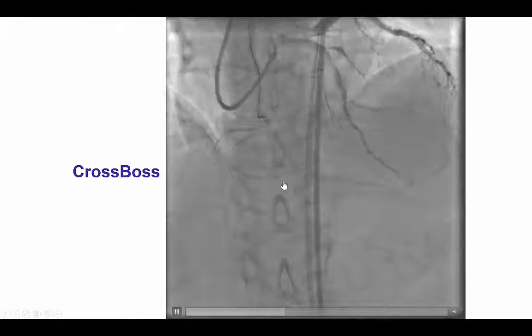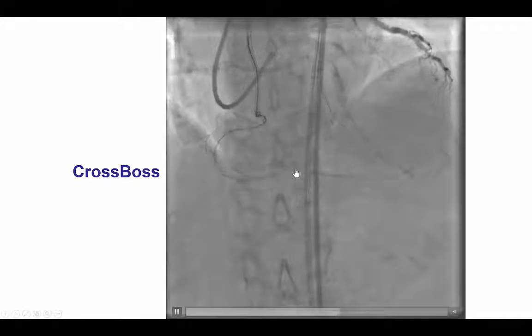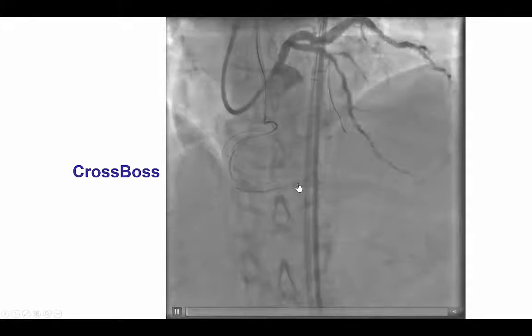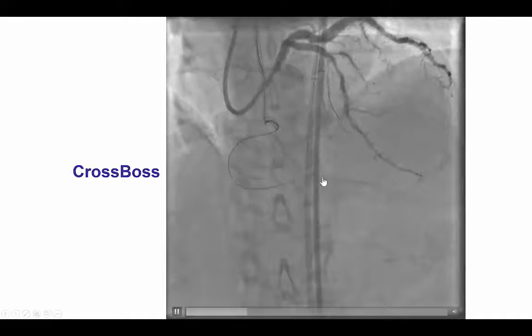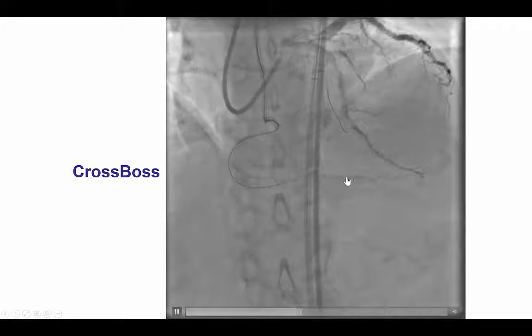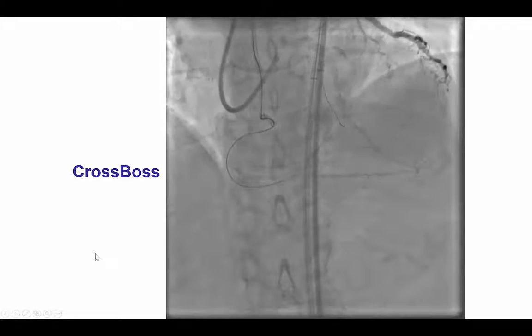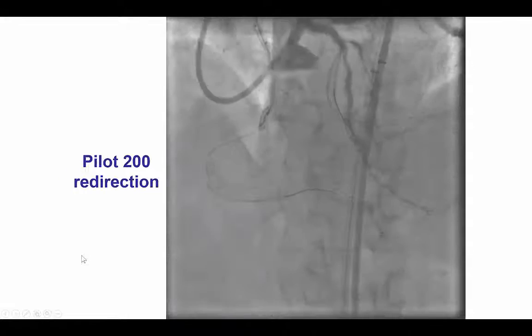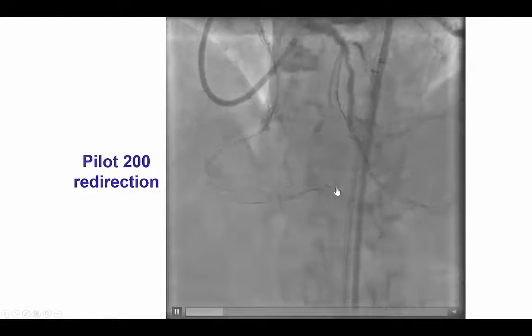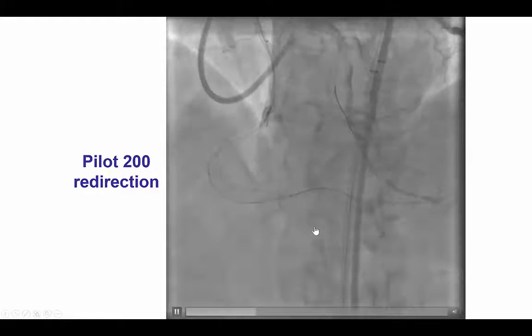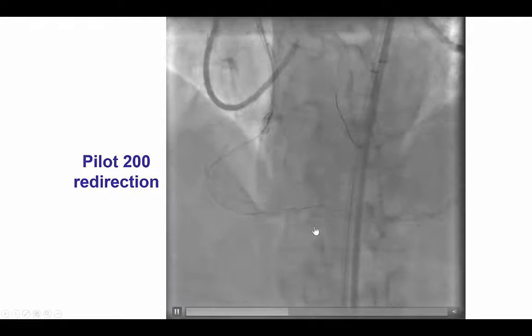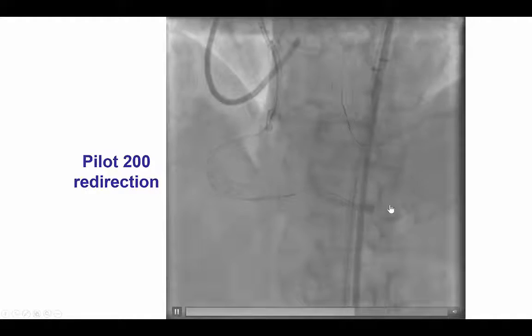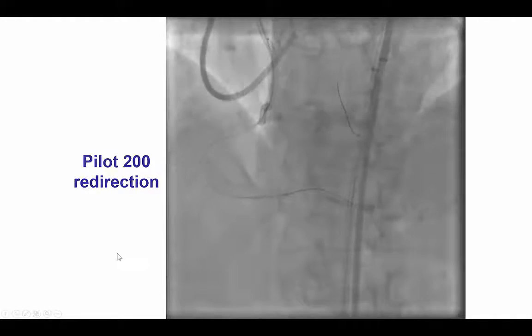We then had some difficulty with the Crossboss catheter, which wouldn't go straight versus taking the turn into the PDA. However, we were able to redirect it by using a PILOT 200 guidewire in the direction of the right posterior descending artery.